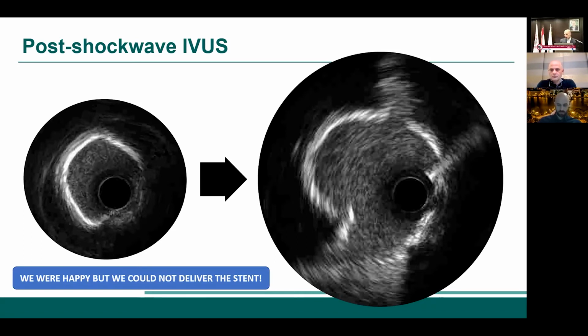But at least the thinking process during that case, and again, they're all great comments, because I fully agree with you. It's a STEMI, it's an 81-year-old. You want to be as simple as possible. If you can just deliver it, and you're there. But the thought was, it's a nodule, something still protruding, not circumferential anymore, yielding on this, but something causing this mechanical obstruction.